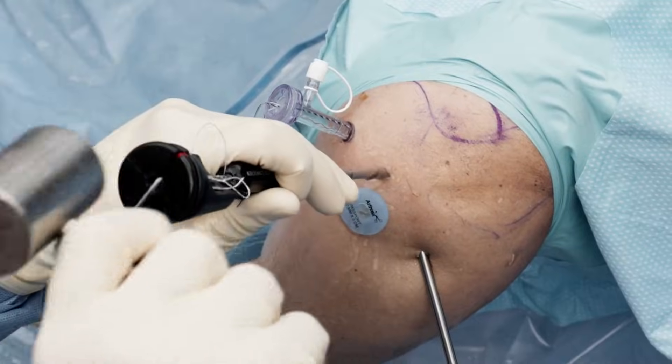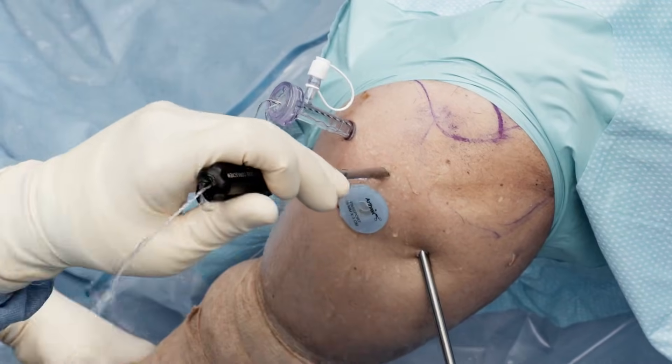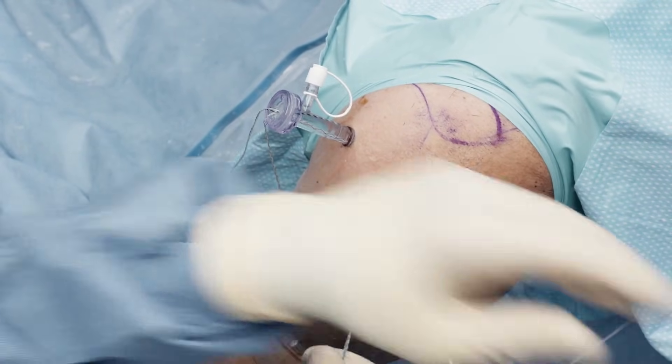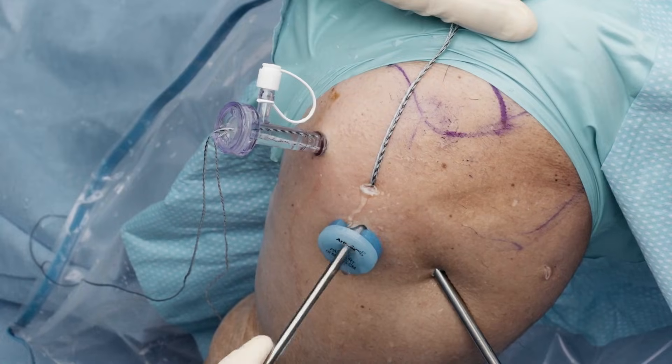Now we're localizing our posterior anchor placement. I want to be right off the edge, similar to my other anchor. I'll check the anchor again and make sure I can lift the arm up — and I can. So we've placed our anchor.